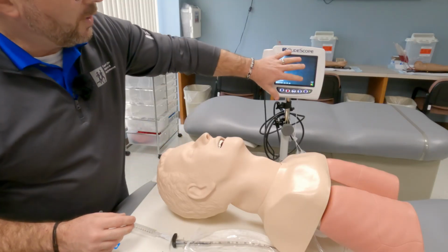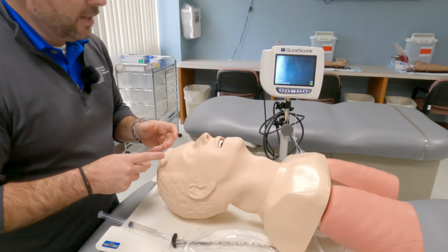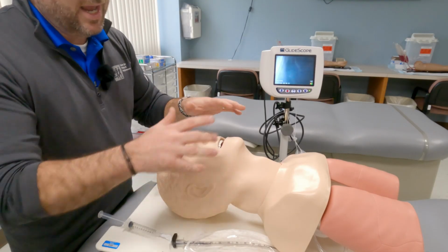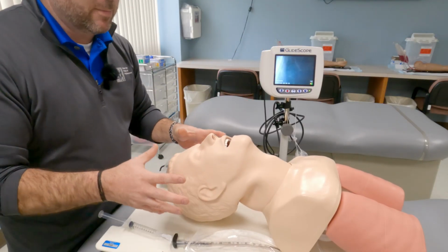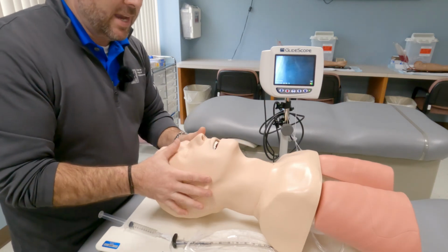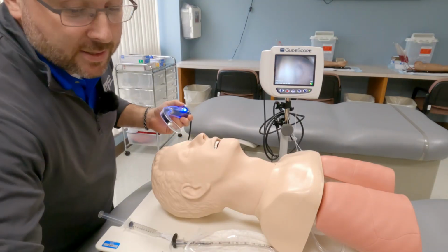You're going to notice we have a camera over on this side. A lot of times this will face the person intubating. With direct laryngoscopy, I'm going to visualize and I'm going to insert. With video, it allows that extra level of I can see it go in and everybody in the room can see it go in. It gives an extra level of comfort to everybody to know that the endotracheal tube's in the right spot. Obviously, you'll still want to check that with capnography or colorimetric change if you have that. Capnography is the best option for that.